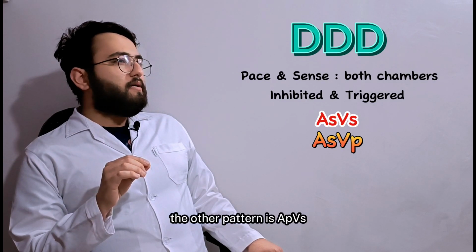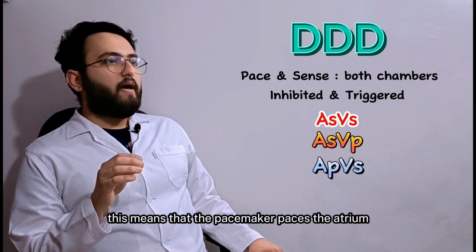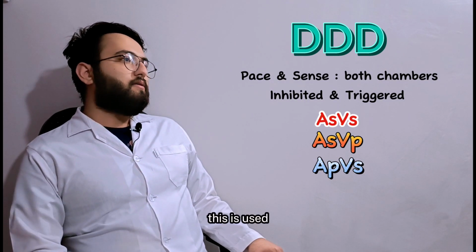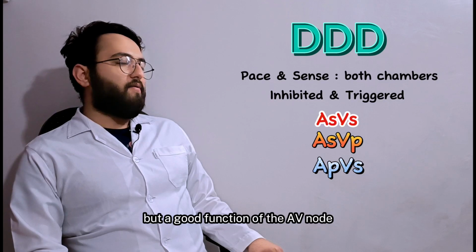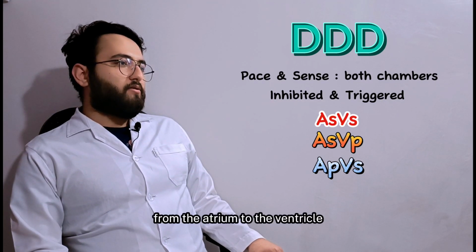The other pattern is APVS. This means that the pacemaker paces the atrium, but it senses a natural heartbeat in the ventricle. This is used when the patient has a poor function of the sinus node, but a good function of the AV node, which allows a normal conduction from the atrium to the ventricle.